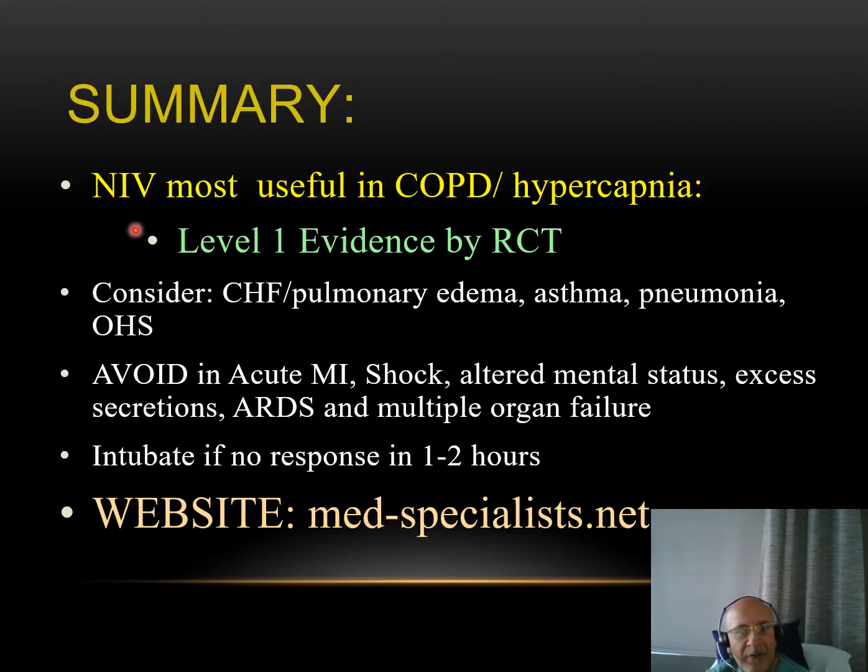In summary, non-invasive ventilation is most useful in COPD with hypercapnia. This is a level 1 recommendation based on randomized controlled trials. Also consider CHF or pulmonary edema, where the patient may not have respiratory acidosis. One should use CPAP 8 to 10 centimeters while the patient is being diuresed. Community-acquired pneumonia, especially if the patient has excessive secretions, may be somewhat risky. Therefore, high-flow nasal cannula might be preferable.